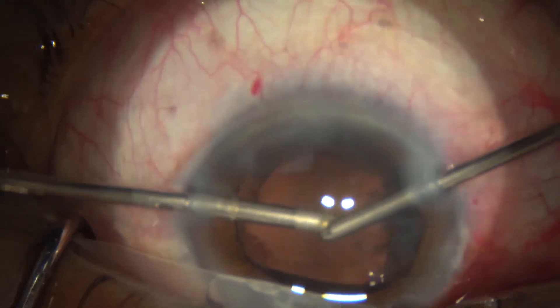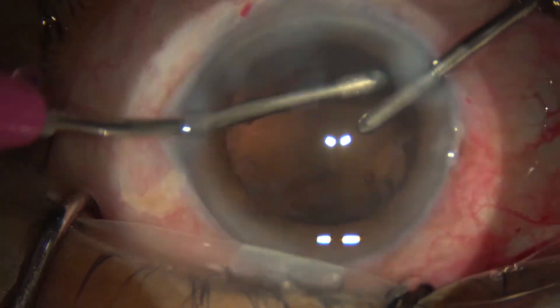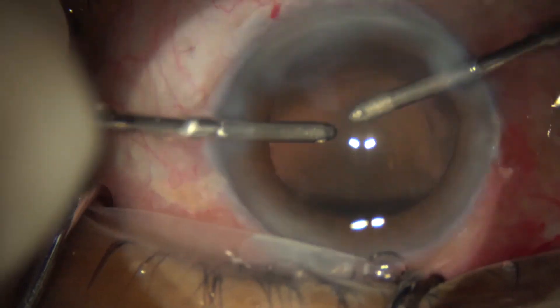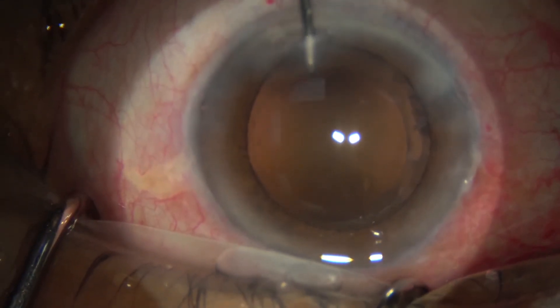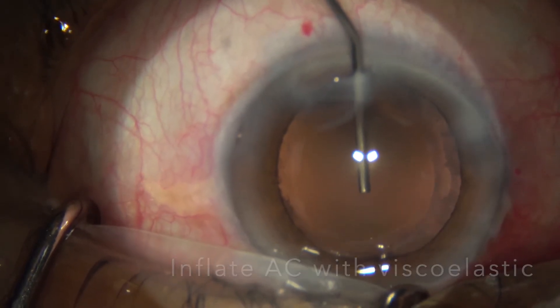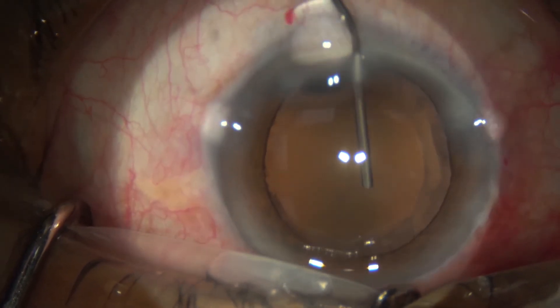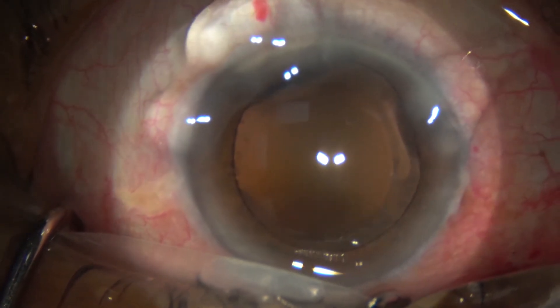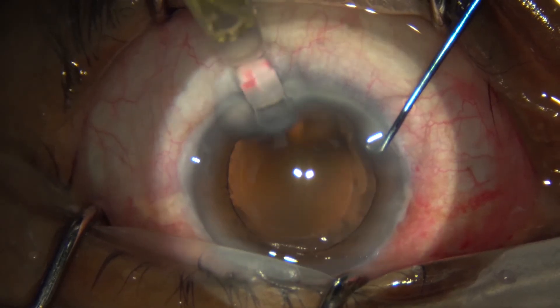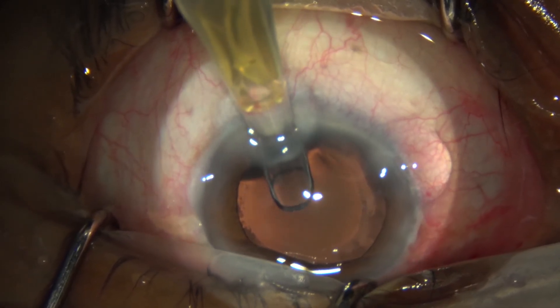Once the nucleus and the epi-nucleus are out, we use irrigation and aspiration with bimanual probes. We then inflate the anterior chamber with a viscoelastic agent, and once that's in place, we insert a blue-filter yellow intraocular lens into the capsular bag.